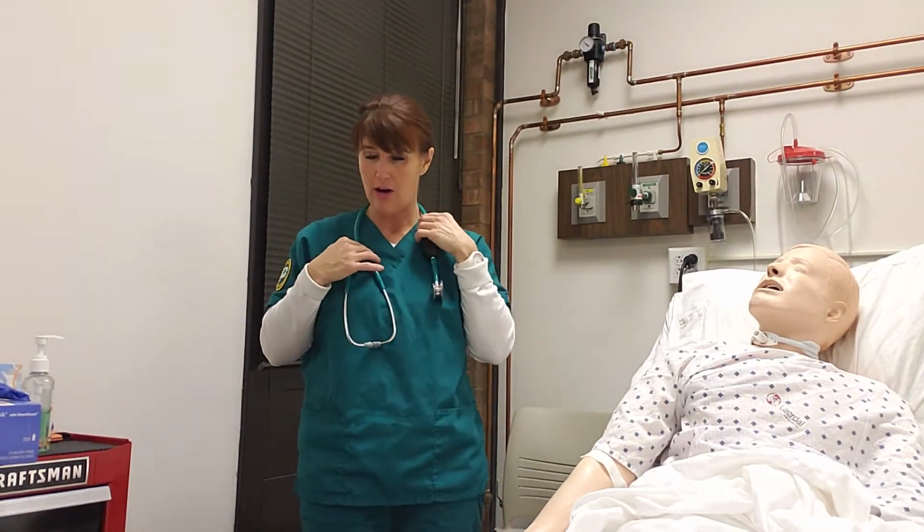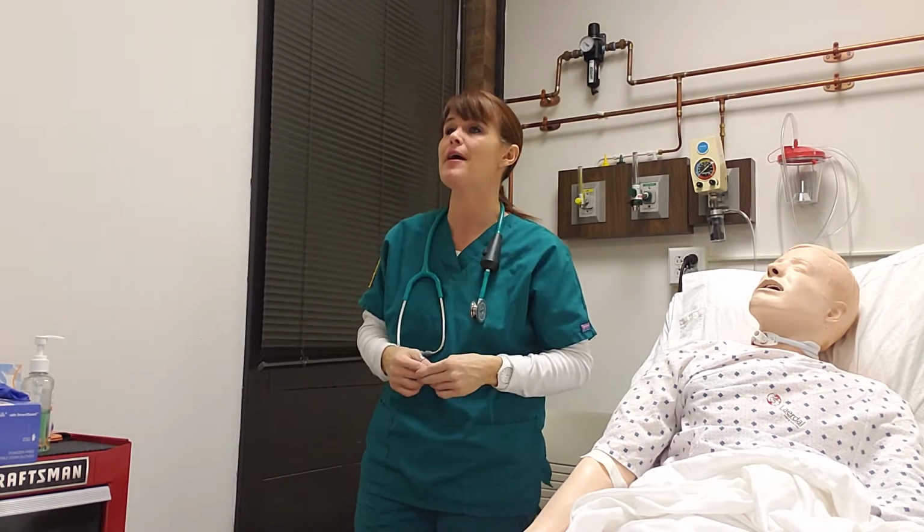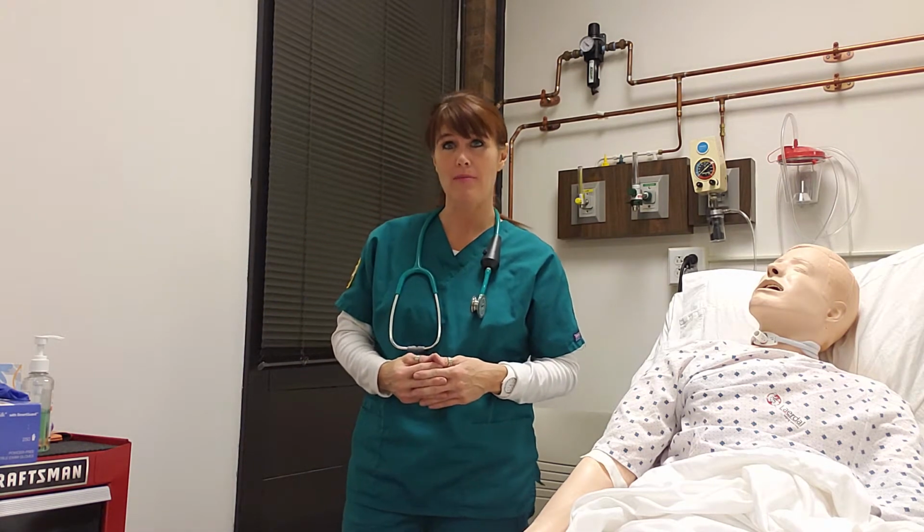Today I'd like to do my competency video for administering a dry powder inhaler, Advair. The first thing you want to do is review the patient's chart and go over the doctor's orders. You always want to perform proper hand hygiene.